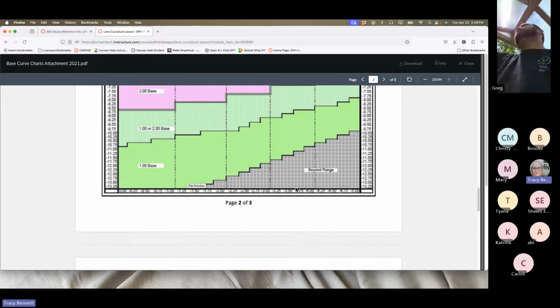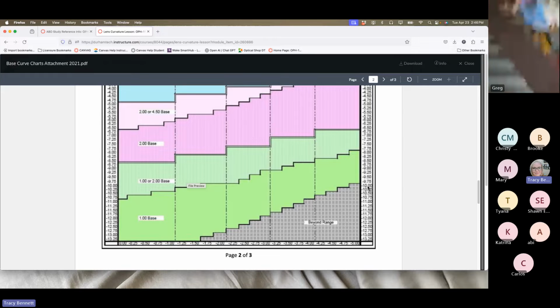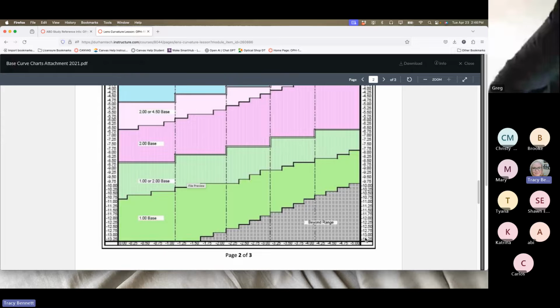The last thing I want to point out is this area right down here. Of course, anything that goes over these power ranges where we have that 1325, once we get into 1350, 1375, 14, 15, those wearers unfortunately can no longer wear this lens and would need a different index or a different lens style completely altogether. On this chart, they do show, because they cover up to a -5 cyl, but not in a lot of these higher powered lenses. Okay.